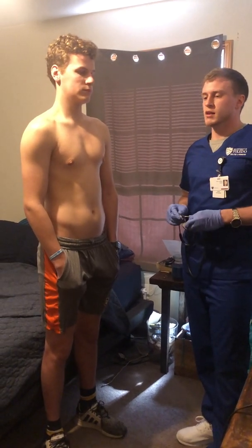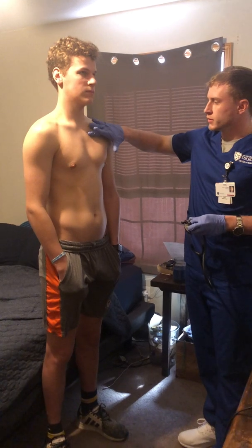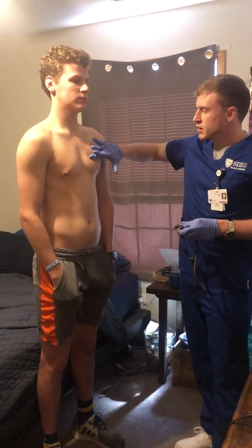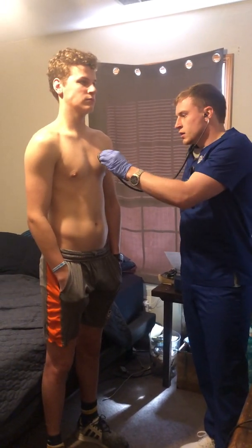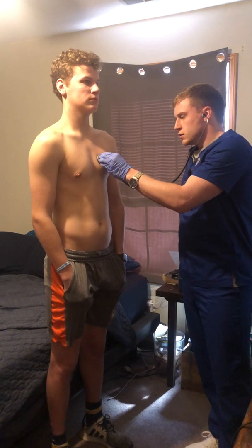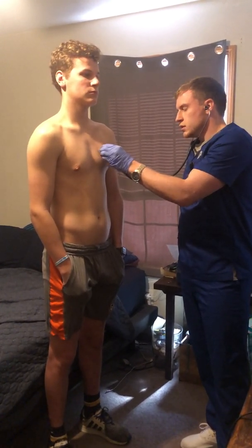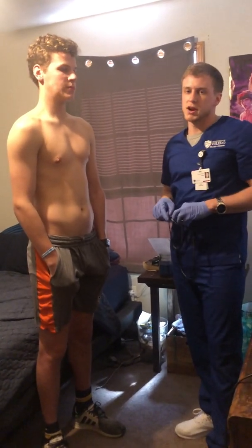So then the fourth sound that we're going to listen to is the tricuspid heart sound. Same thing, we're going on the left side, we're going down to the fourth intercostal space on the sternal border, and I'm going to go ahead and give that a listen. Alright, all seems normal.